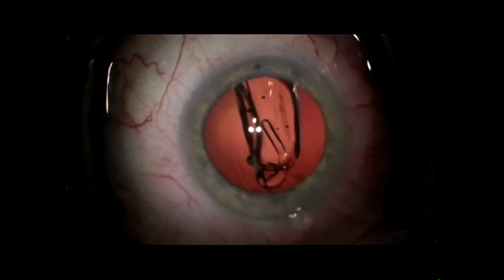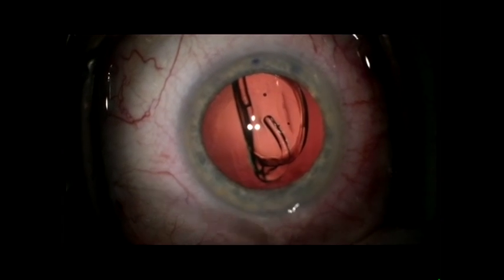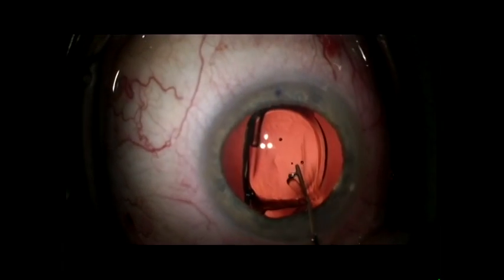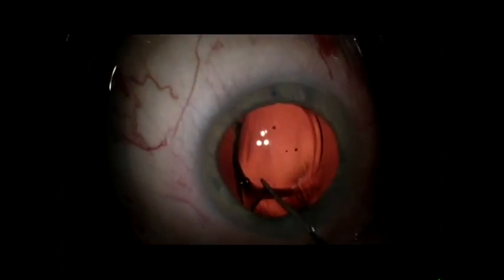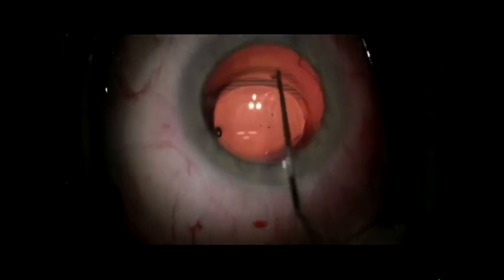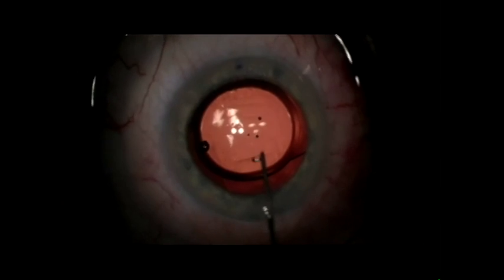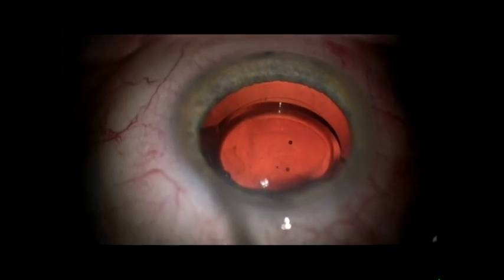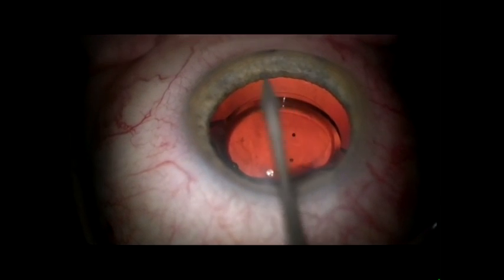You need for this procedure the iTrack micro catheter, the Helon GV for the micro catheter and to use under the gonial lens. I use a 20-gauge MVR blade, which I will demonstrate — smooth jaw intraocular forceps, loop forceps to handle the micro catheter without damaging it, and also a routine Lester lens rotator.